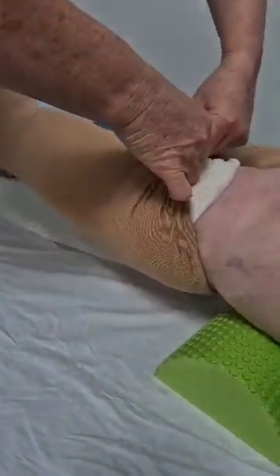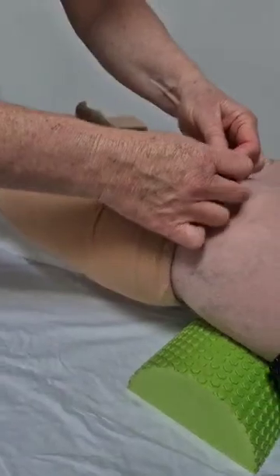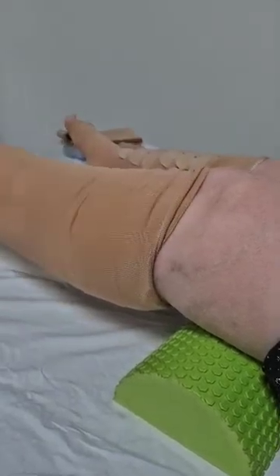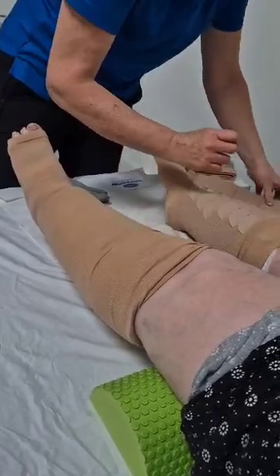And if you find, Jenny, that these are too restrictive at the top, you could just cut that bit off. Like it's not really important. We don't want to be creating, that is a little bit snug at the top.